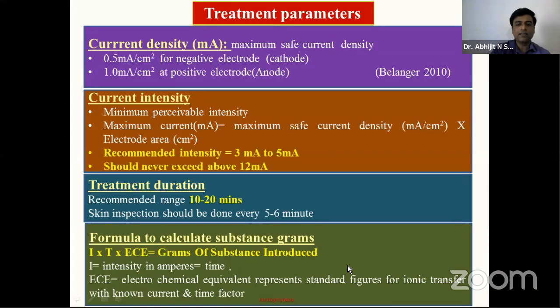Now these are the standardized values which we can obtain, right? Which are used for the iontophoresis. Now the traditional electrodes we use in our departments regularly can be metal, tin, copper, lead, or aluminium electrodes, which are covered with sponge, towel, or gauze with skin contact. Okay. Another type of electrode is the commercial electrodes. Over here, we can see the different commercial electrodes which can be used.